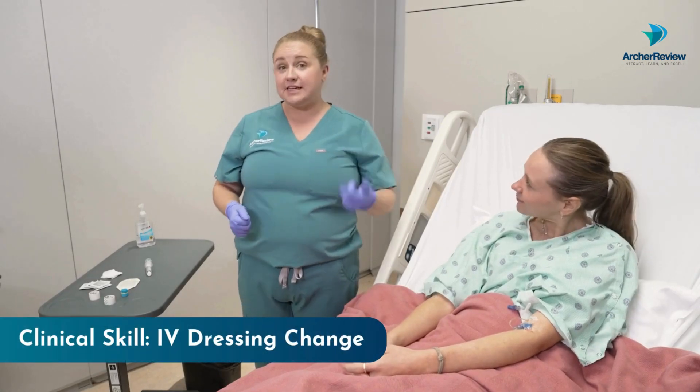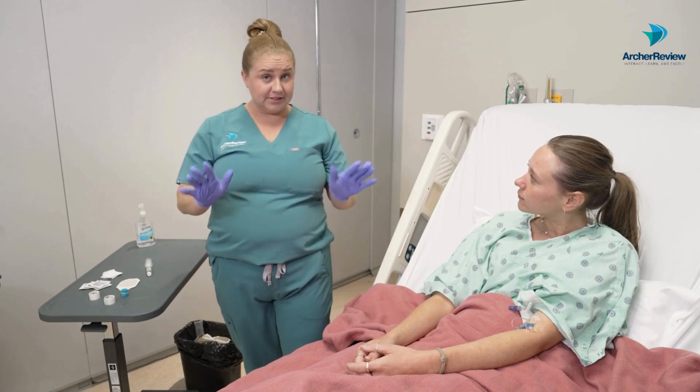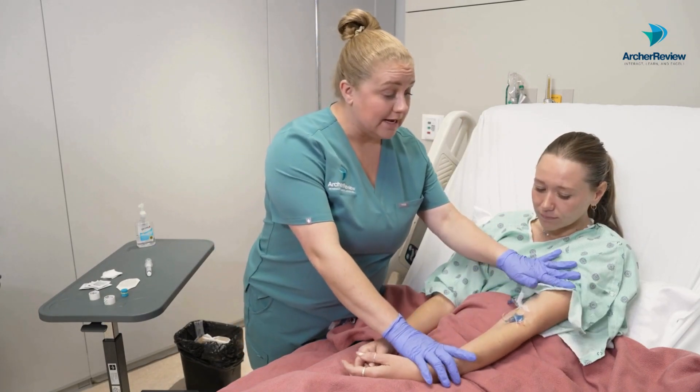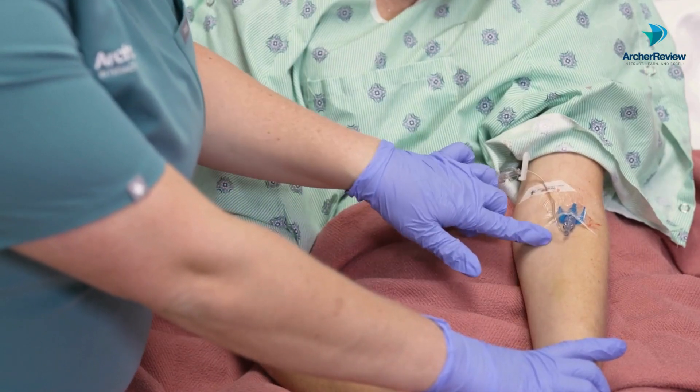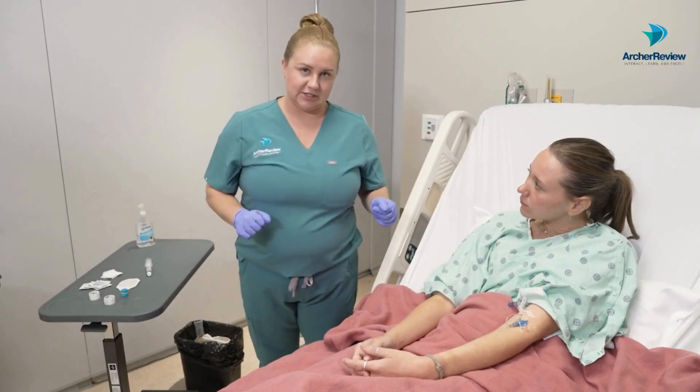Dr. Taylor back with Archer Review, and today's video is covering an IV dressing change. As you can see, our client Ms. Caffrey's dressing is looking pretty ugly — it's all wrinkled up here, we've got some blood on it, definitely time for a dressing change.